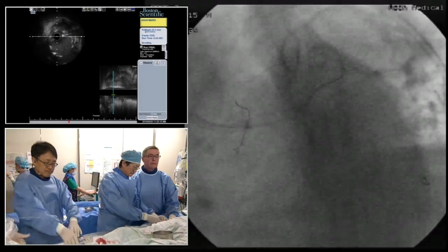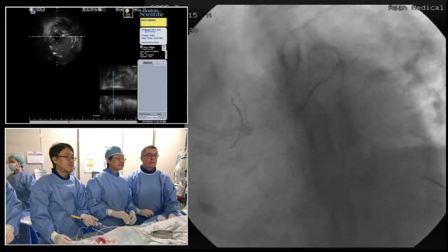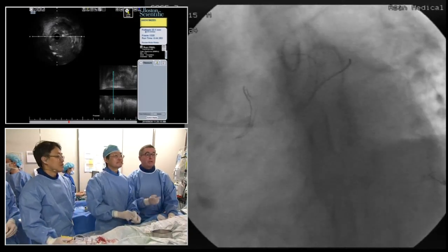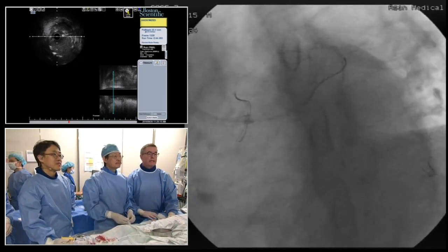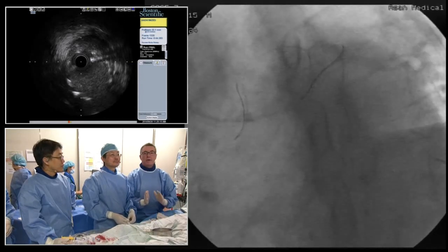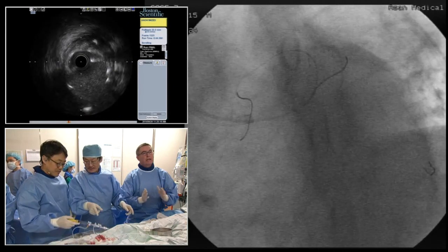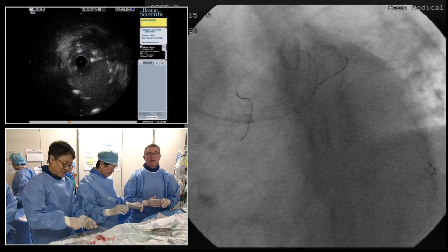So Ian, this is Chuck Simonton. What do you think the percent stenosis is right now at that diagonal ostium? What would you call it? Oh, it's probably in the 40 to 50% range. But what we need to do is probably go to the cranial view and have a look at the ostium of that. But again, it's a narrow angle, Chuck, and if we try and treat this, we'll end up with some stent protrusion. T-stent technique is not going to be ideal.